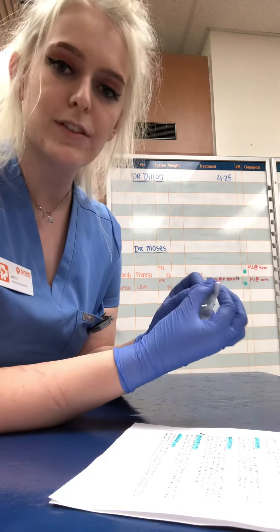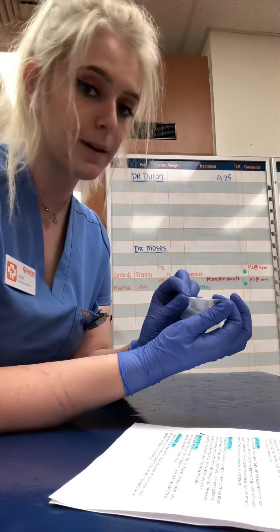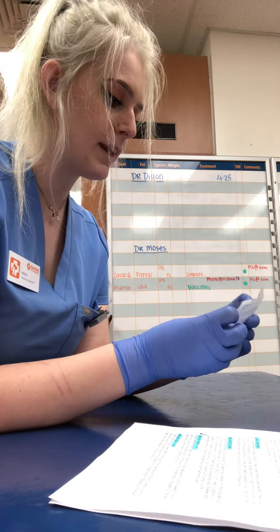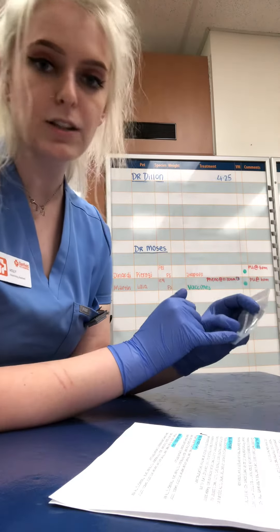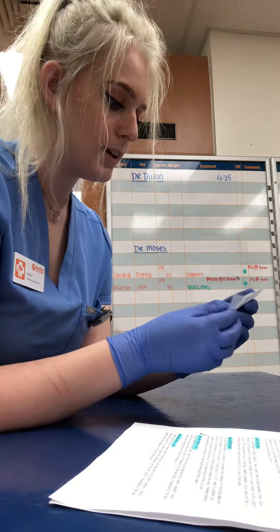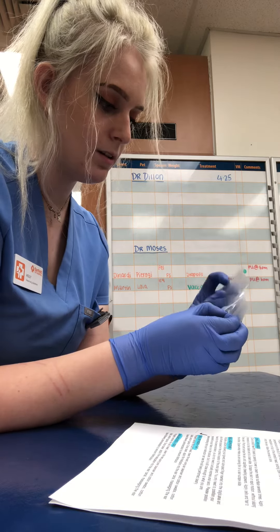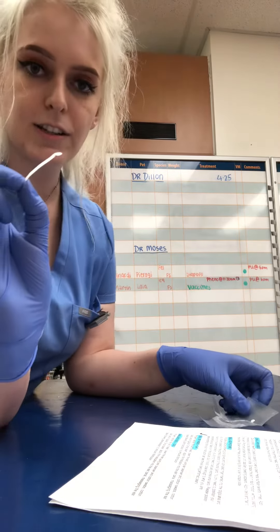Bending at the notched area is going to give us the curve that we need while keeping the strips sterile. Making sure that I'm using the left strip — it is indicated with an 'L' — I will then take the strip out, and you can see that there is a curve present.